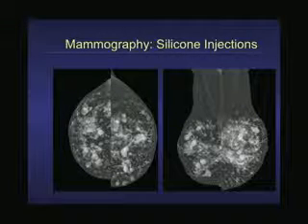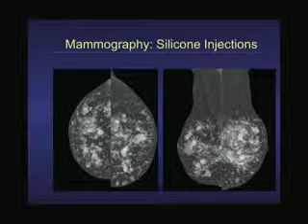And some women, unfortunately, not in the United States, but in many Asian countries, they'll inject the silicone straight into the breast. I see way too much of this at the county. They'll inject silicone, paraffin. There's a new gel that they're injecting both in South America and in Asia because it's less expensive, right? It doesn't require surgery. And so you've got a lot of doctors, or maybe even non-doctors, just injecting this stuff in women for augmentation. As you can see, it would make a mammogram very difficult to interpret. It's going to be very hard to see something bad going on in this kind of background.